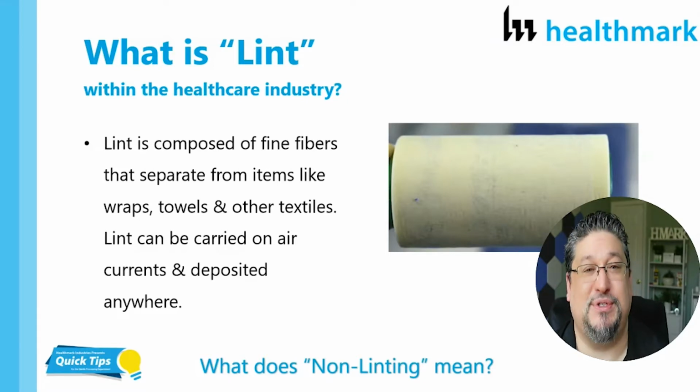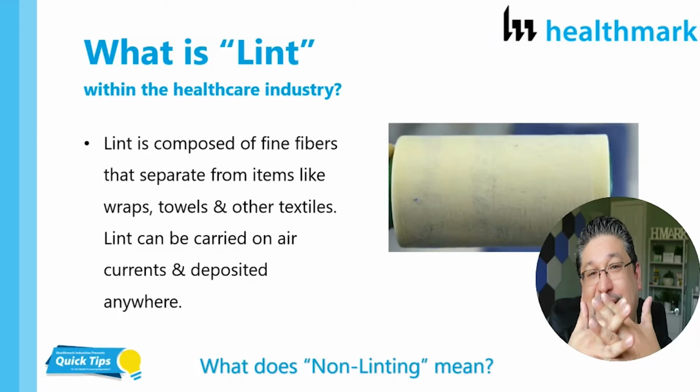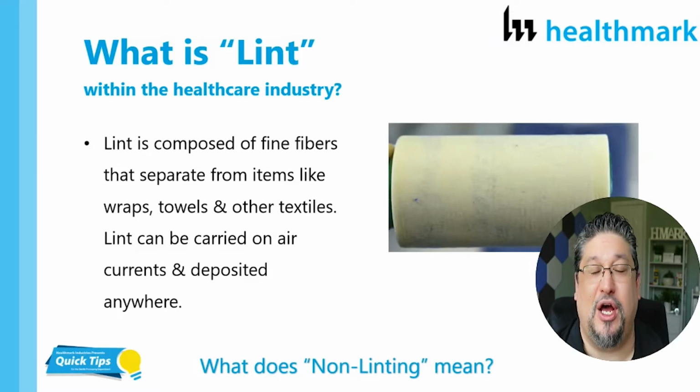There are various types of woven and non-woven materials when we talk about linens and cloths and other things. Woven materials are essentially sewn or interconnected together, and non-woven materials are bonded together using either a chemical, mechanical, or some type of solvent process. But whether they're woven or non-woven, both of them use very, very fine fibers that are put together to create this larger thing.